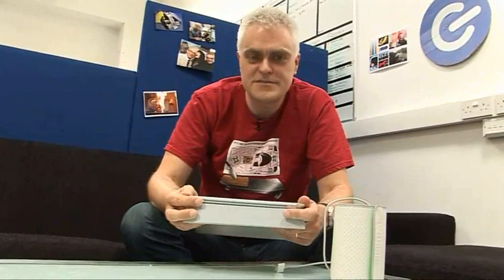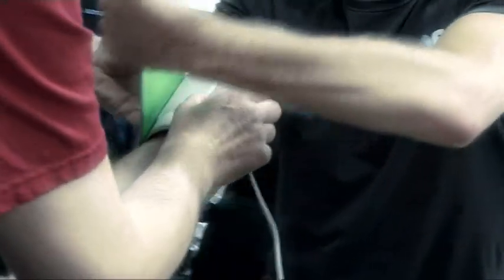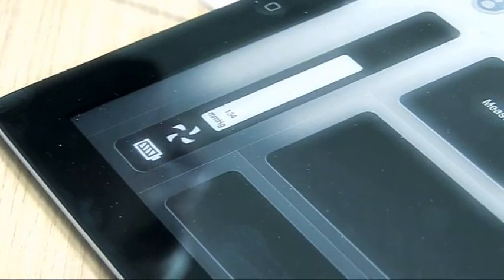I've got slight reservations about keeping all my health information in the cloud, though maybe other people wouldn't be so worried. I tested it on Tom in the office and he thought the readings were more or less what he'd expect. I also tested it at home where I compared the results with my own Omron blood pressure monitor, and again the results were broadly similar.